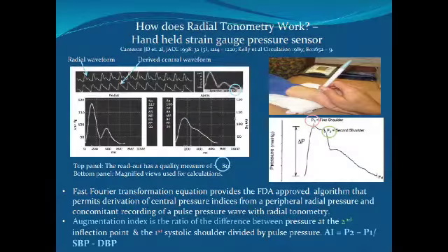What you develop is something called an augmentation index, and it has been associated with cardiovascular risk. I'll show you how you get that in a moment. It also predicts the presence or absence of coronary artery disease in terms of plaque. And it's an independent predictor of not only events like heart attack, but also of death. So pretty compelling data from a little tiny device that just looks like this. You apply it over the radial artery and it generates a curve, and we'll talk more about that momentarily.